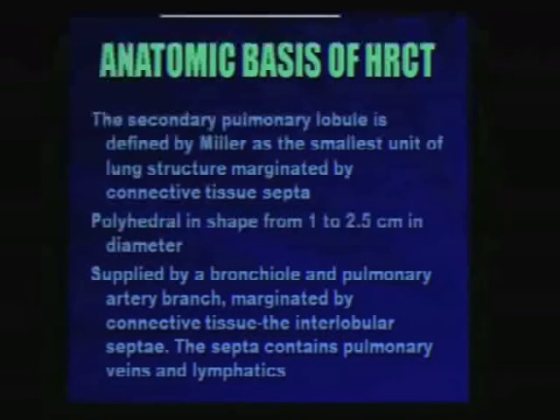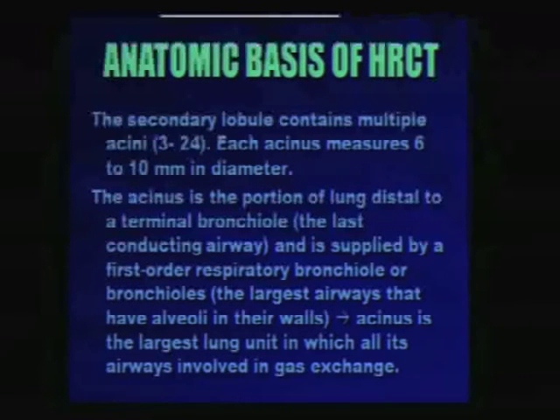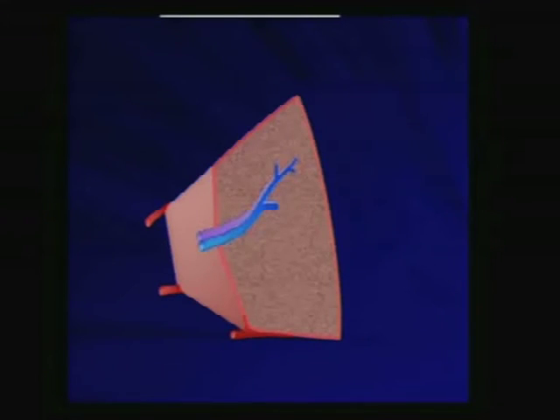I'm just going to go very briefly, and I'm sorry if I'm going through something that is very basic, but it allows you to understand what happens in the lung parenchyma. And once it happens, how can you recognize it, and how can you separate it from different processes, from interstitial and alveolar in particular. I'm not going to go through this, and I'll be glad to provide this as a PDF file for people who are interested in some of the diagrams and the basic anatomy.